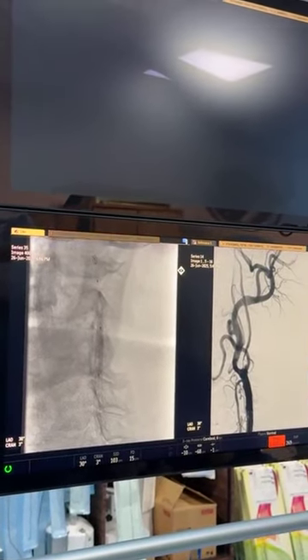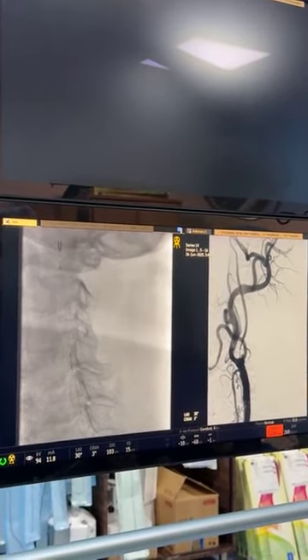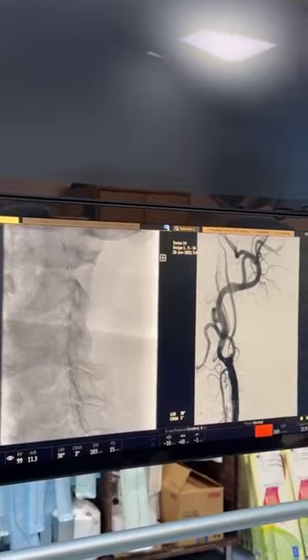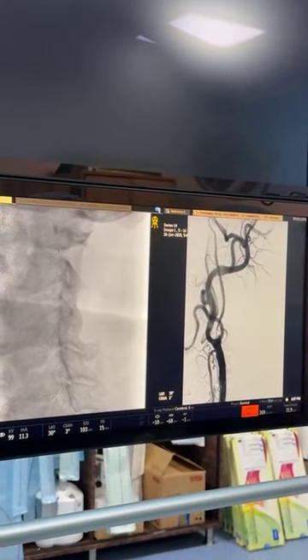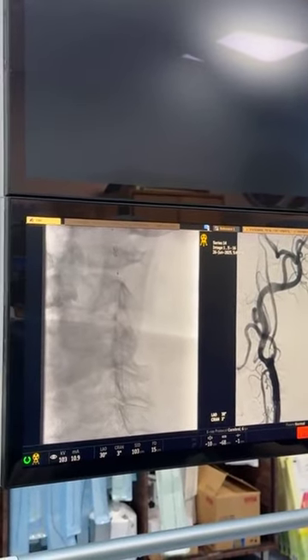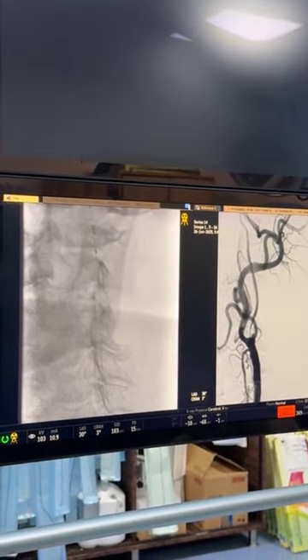How is the patient, Dr. Sujit? Yeah, he's comfortable, sir. So the best thing is the patient is conscious and quiet, and we can talk, we can discuss, we can find out what is happening. So as Dr. Sujit, our chief of cardiac anesthesia, has already described, they prefer it to be under local anesthesia so that they can do neurological monitoring very easily.